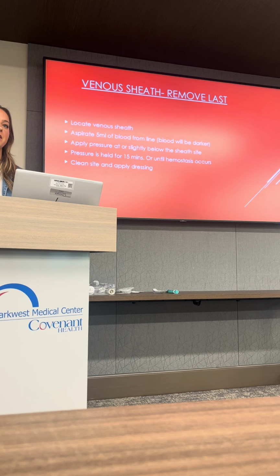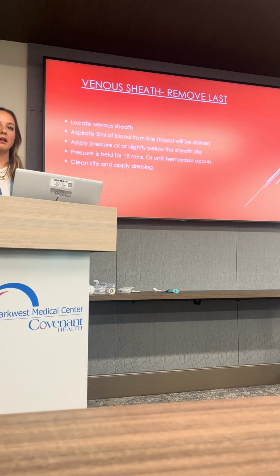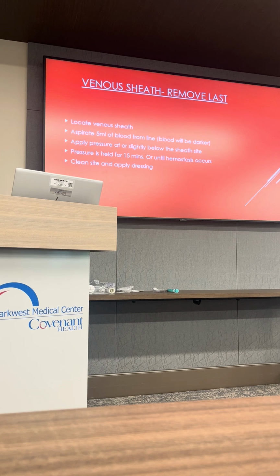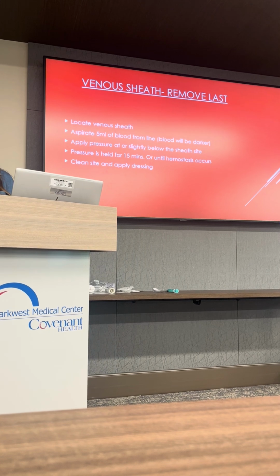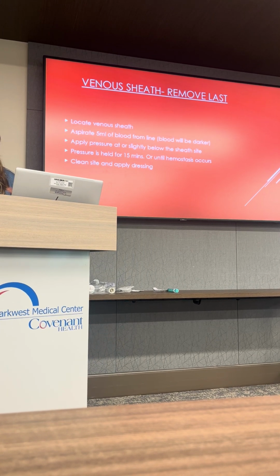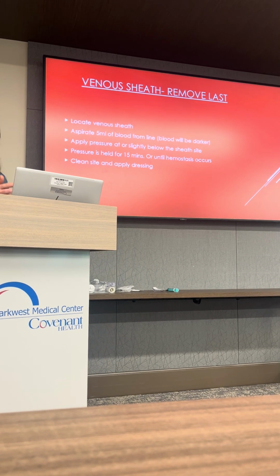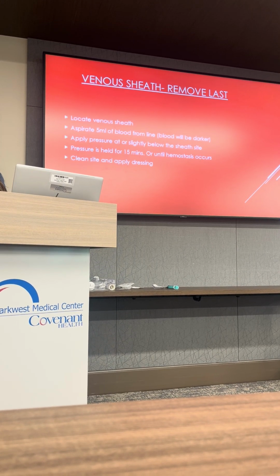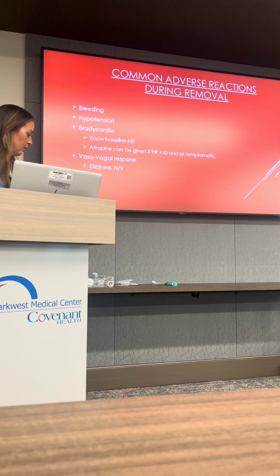Sometimes these people don't need pressure held that long, but a good rule of thumb is 10 to 15 minutes at least. Again, you just want to be sure that you're going to get the end result, and you're not going to come back in 10 minutes later after you've pulled this and see blood in the bed and different things like that. It's just better to go ahead and stay present and be aware of what that can look like, and just continue to hold. I know it's miserable to hold pressure, but it's better to do it on the front end than have to do it later.